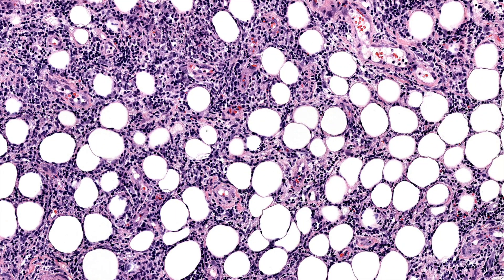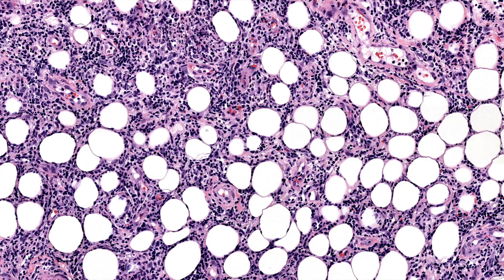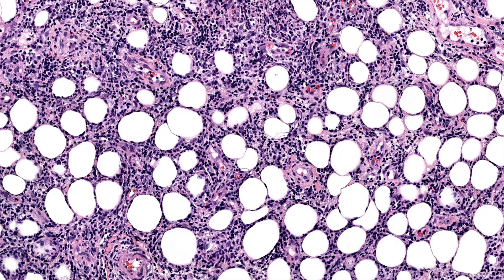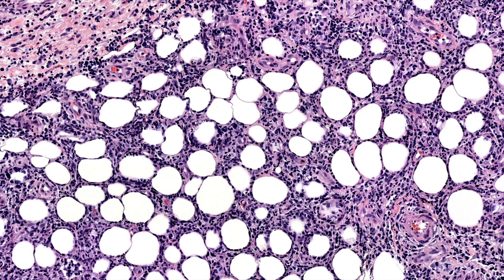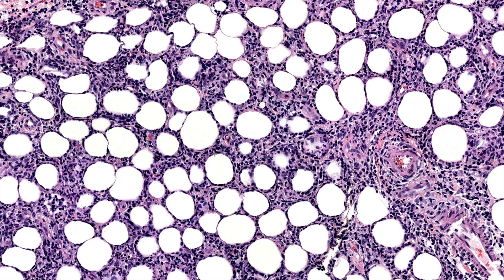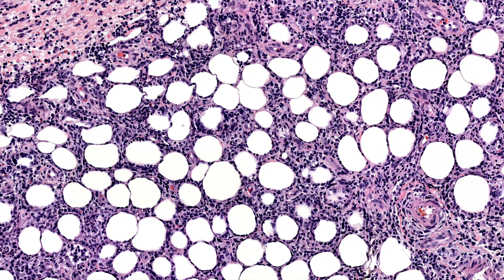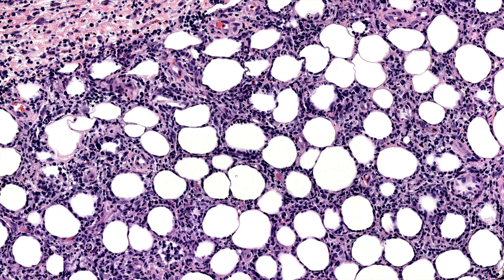I have a hard time, unless the lymphocytes are dramatically atypical, determining lymphocyte atypia because I think it's kind of subtle. But even for me — I admittedly struggle with this sometimes — these look really hyperchromatic. They look very dark and big. And then, like you said, they are rimming. This is the classic finding: they are rimming and wrapping around individual fat cells, which are totally encased in these atypical lymphocytes. So that rimming of atypical hyperchromatic lymphs around individual fat cells is the classic buzzword finding for subcutaneous paniculitis-like T-cell lymphoma.